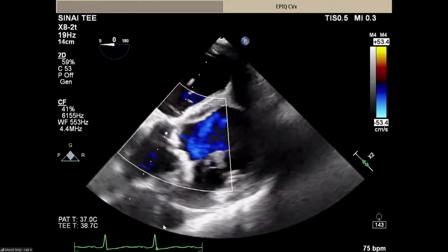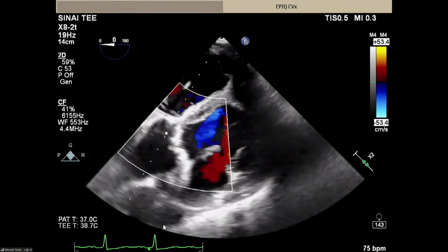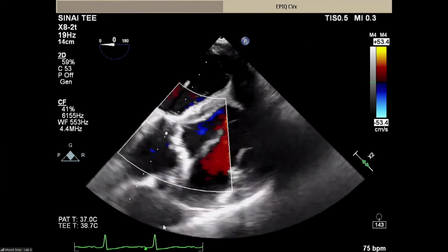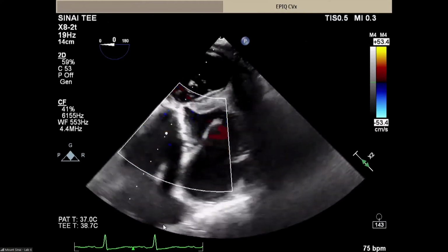And the last view, this is the view that we use after the valve is deployed. This is a gastric view to evaluate the gradients and also to evaluate for valvular, but most important in this particular case, for paravalvular regurgitation. That's what I have to say. Back to Dr. Sharma. Okay, all right, we can go back to the slide.